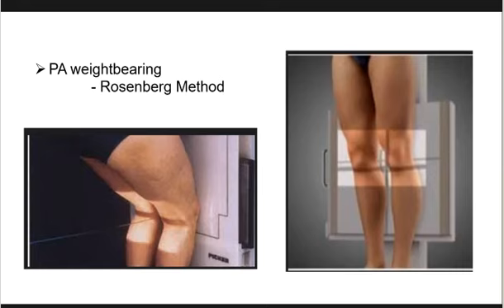So minsan dito sa right image naman, kumukuha din tayo dyan. Pag ang pasyente ay nakatayo, ibig sabihin weight bearing method ang tawag doon. So laging tatandaan, pag mayroong question na ang sagot ay weight bearing, the patient is always in upright position.